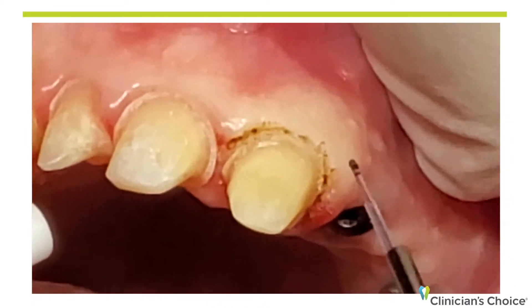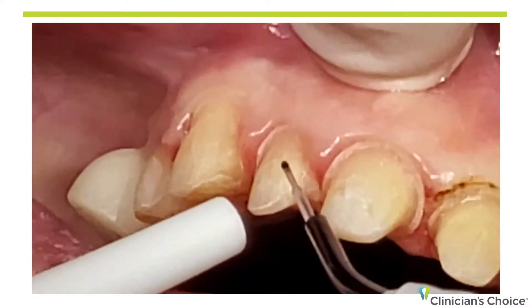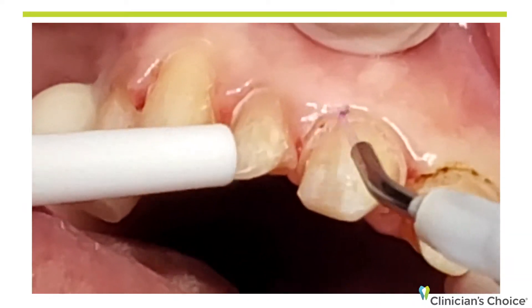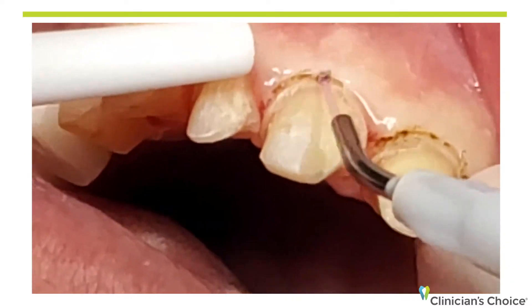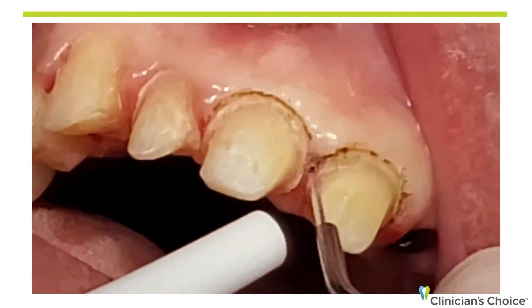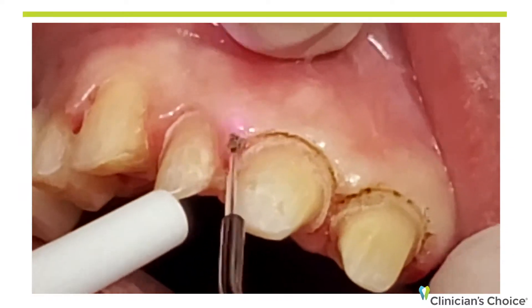I've created a trough. I'm not worried about the ragged tissue because that will clean up in a few seconds. I'm going to go on to the next tooth — turn to me a little bit — and once again with a gentle stroke, trough that anterior. You do not need a lot of energy for this. Six tenths of a watt is plenty if your hand speed is nice and slow. The Blue Wave is a very powerful soft tissue diode laser.